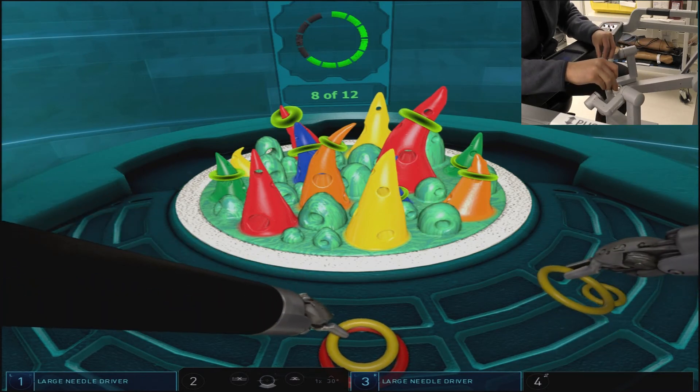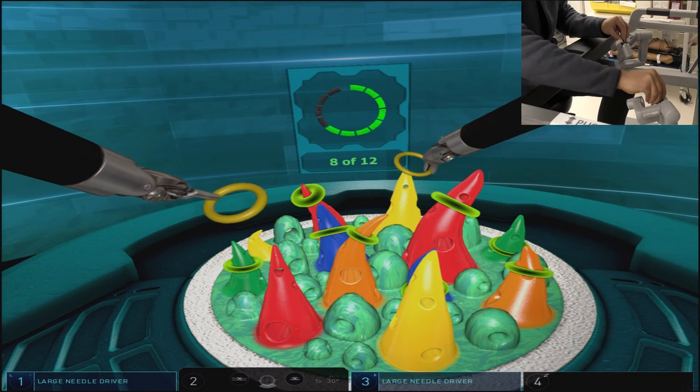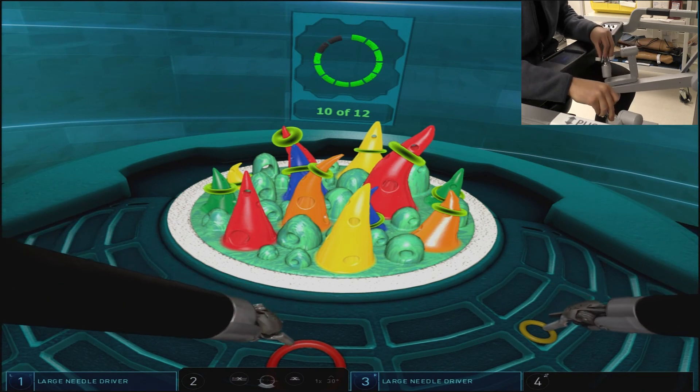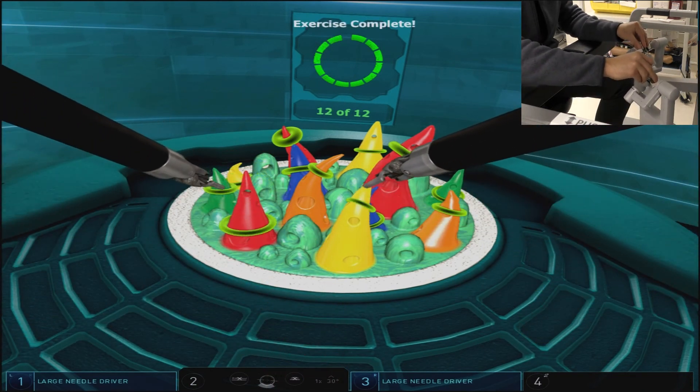You'll see the colors remain coordinated up until the last pair, where the two foremost and easiest placement cones are there.